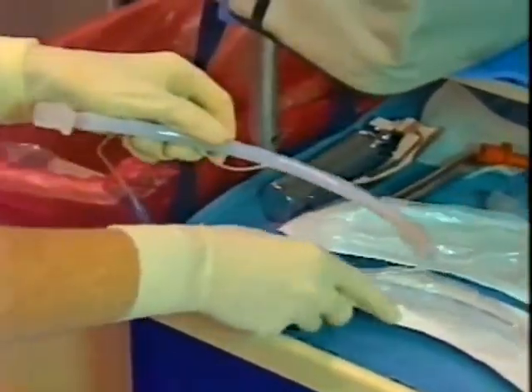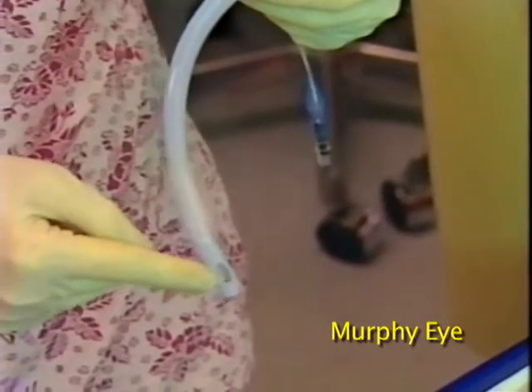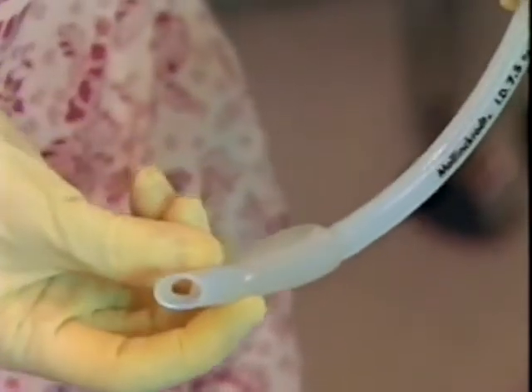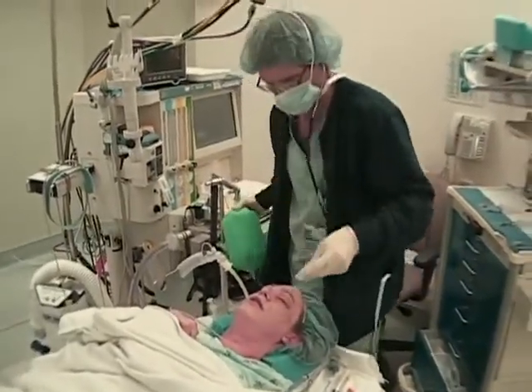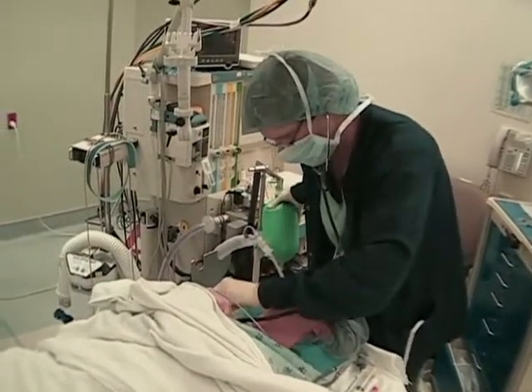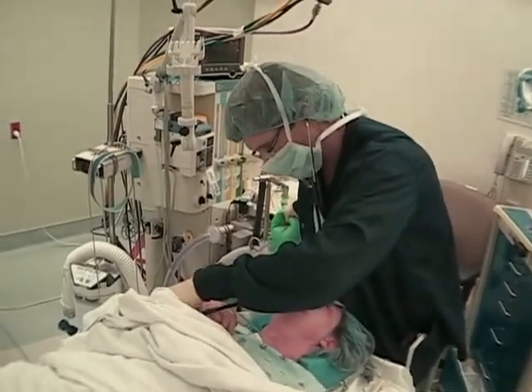The endotracheal tube has two openings on the patient end. The side opening, called a Murphy eye, prevents obstruction when the tip of the endotracheal tube is up against the tracheal wall. The beveled tip serves the same purpose when the tip is up against the carina. Positive pressure ventilation depends on providing enough pressure to inflate the lungs. If there is a break in the pressure seal, such as through a leak around the endotracheal tube, then ventilation may be inadequate and the patient can potentially aspirate around the tube.